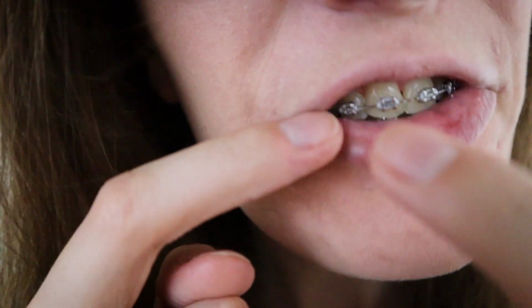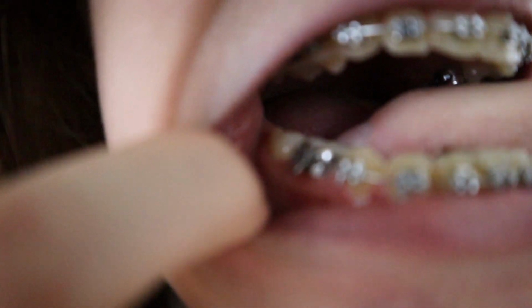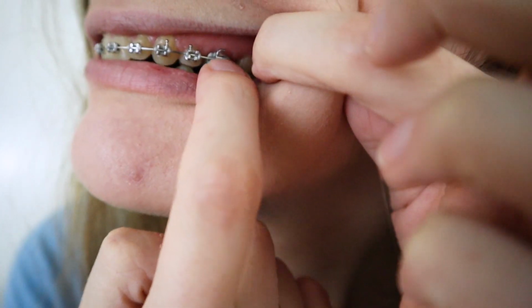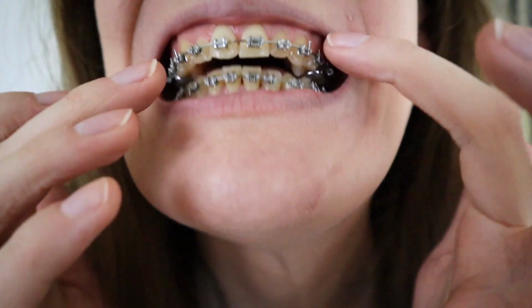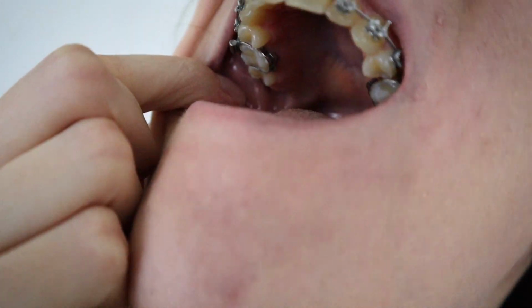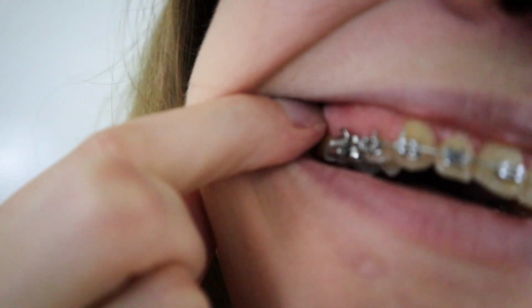And you guys asked to see more of the band, so I'm going to try to show you, but it's really difficult to get in there. And the top, I have this little bar here, and then a little hook on the inside and the other side, and then the little hook and all of that. So that's about as close up as I can get with these without putting the camera in my mouth, which wouldn't work anyways because then it would just be dark. But yeah, that's what's going on there. So we have these all moving around and we wait for this one to move forward.